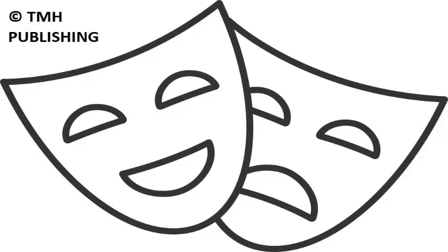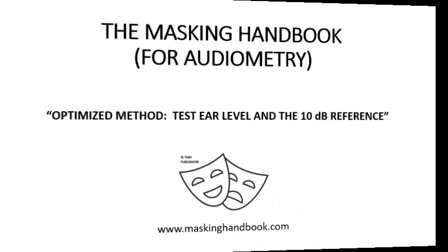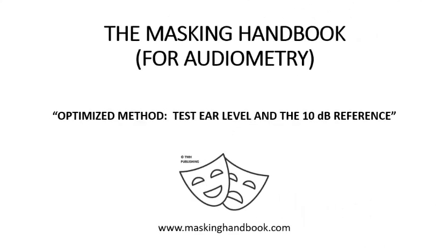This is the Masking Handbook for Audiometry. In this video, we'll be looking at why masking at a level that's 10 dB below the level of the test ear signal cannot result in overmasking.